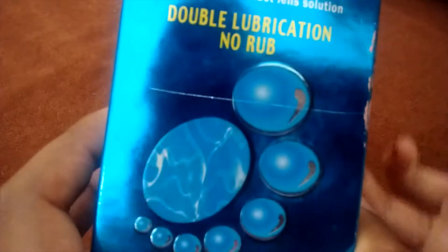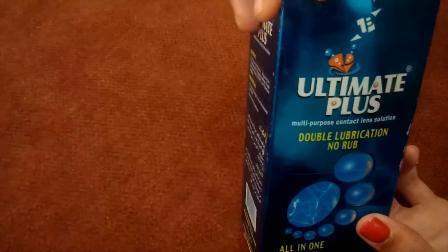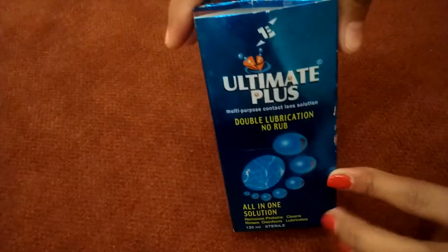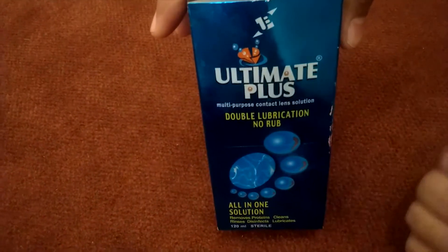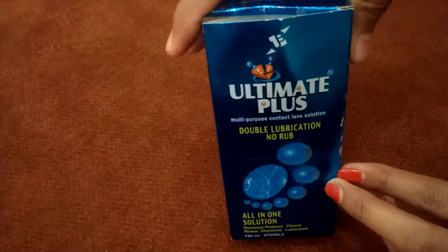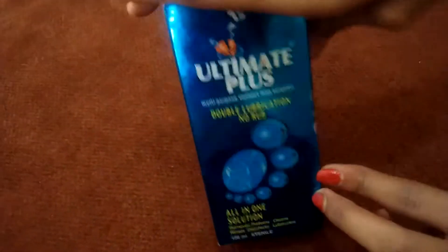I would like to share my personal experience with this Ultimate Plus lens solution. It is very good compared to other brands in the market. It cleans the protein, debris, and all the dirt which accumulates on the lenses from daily or all-day use. So you definitely have to try this solution.